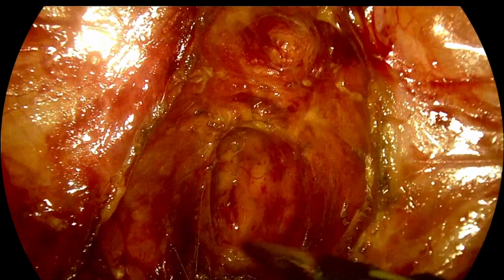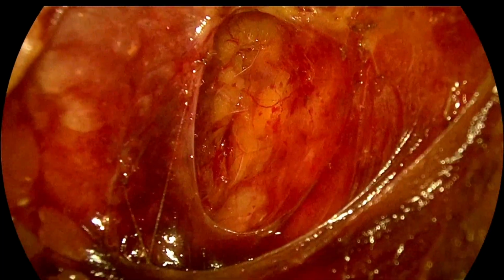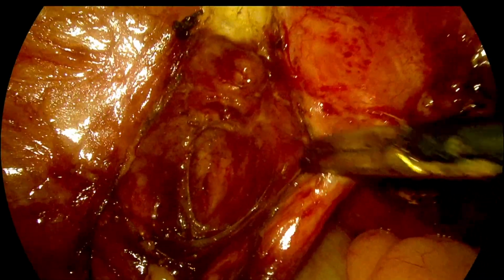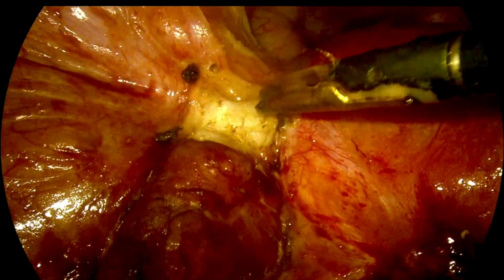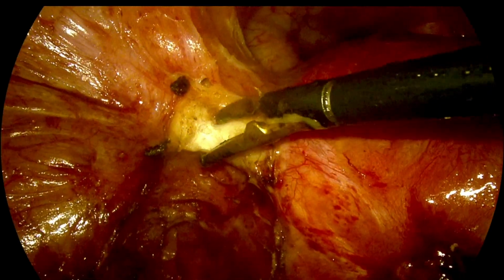Where we can identify the ureter by its peristalsis. So once we identify that, now it becomes easier from our side to divide the rest of the pedicles. So that is the round ligament we are able to identify and divide it.